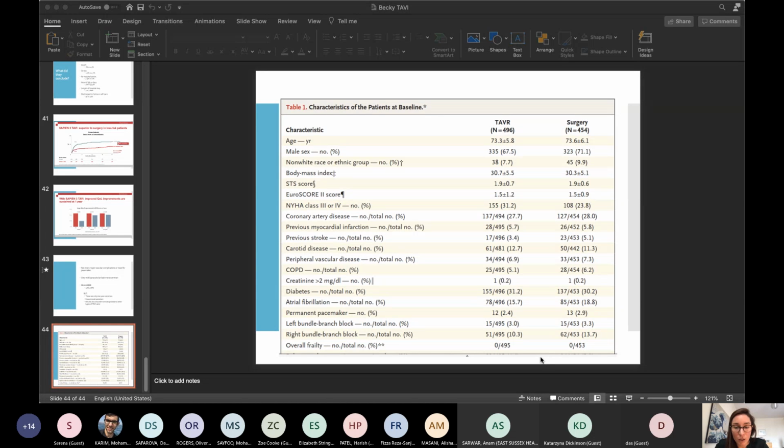And on the whole, it tends to be most commonly small events, and it's debatable how much of the stroke that you see is to do with little bits, as opposed to dislodging major clots.